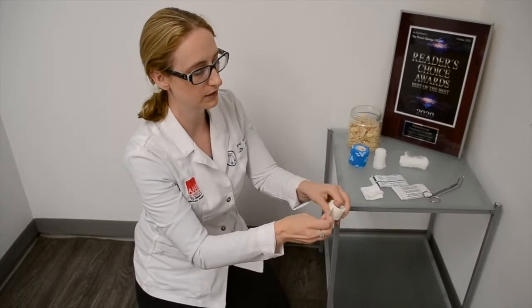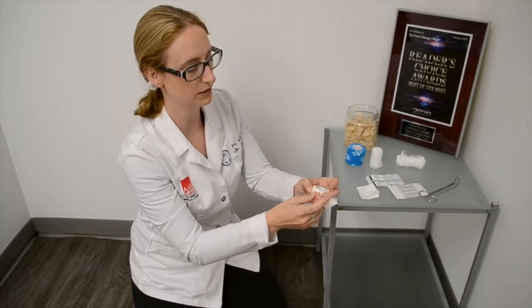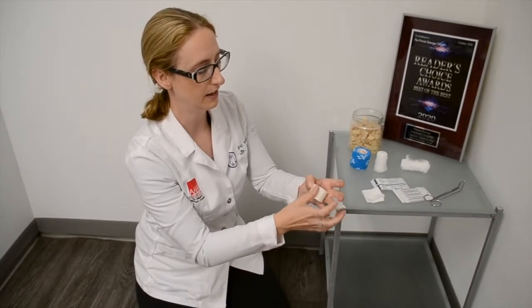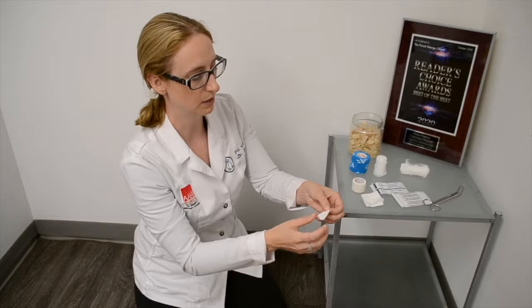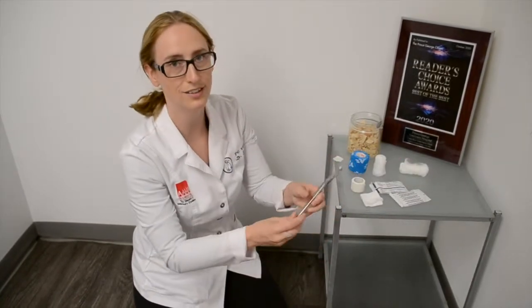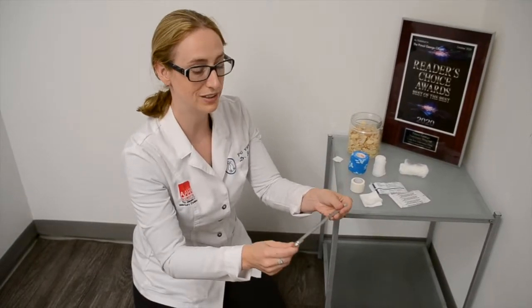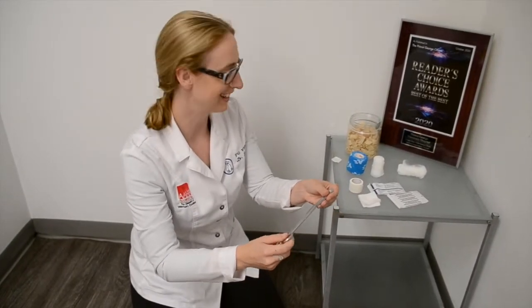Now the final thing is, this is just basic white tape. It comes off like this and it's tearable. This is really nice and handy, particularly if you are hiking and you want some tape, because you can make it any size that you like. And then finally, scissors. These are quite large, but you can get smaller bandage scissors. But these are vital to your bandaging kit, okay?